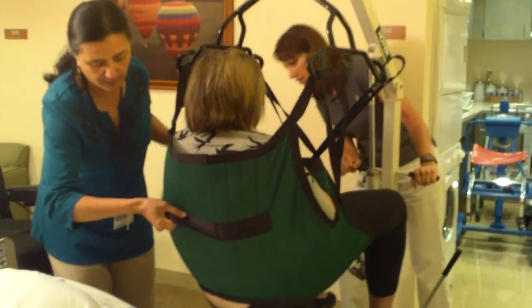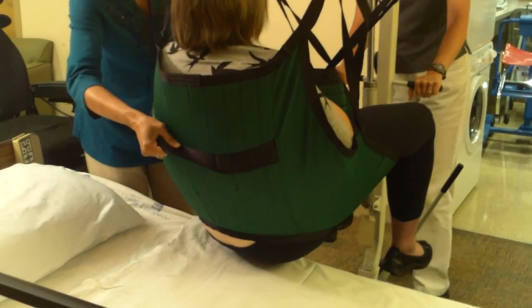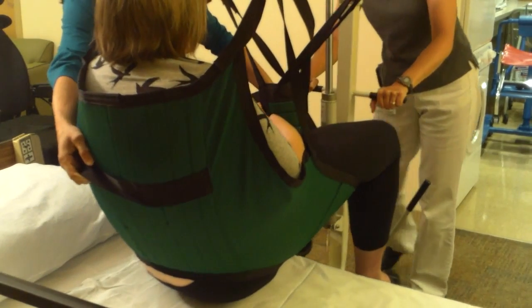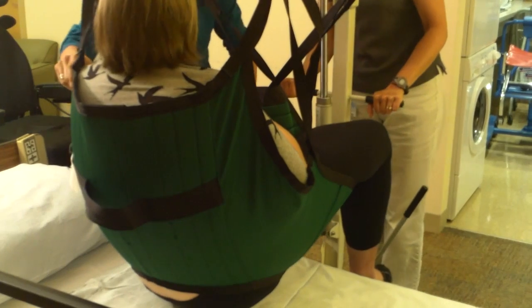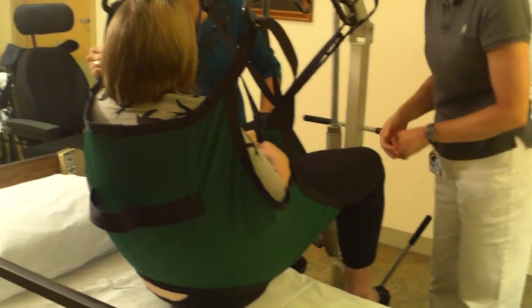You can move the patient out from between the wheelchair and then position them at the spot in the bed that they need to lay down in. Try to have the patient as high up in the bed as possible so that they don't slide down when they lay back.